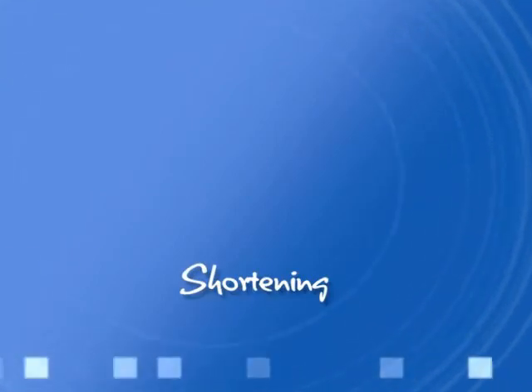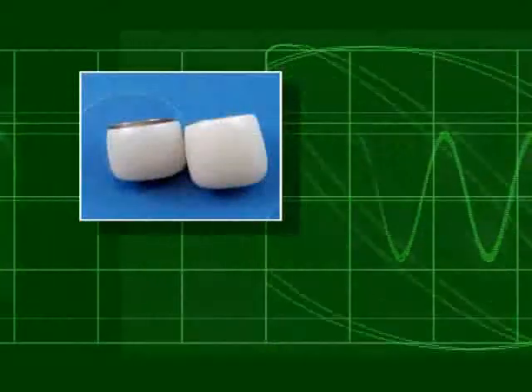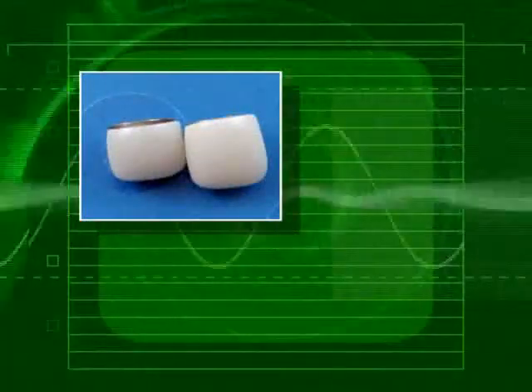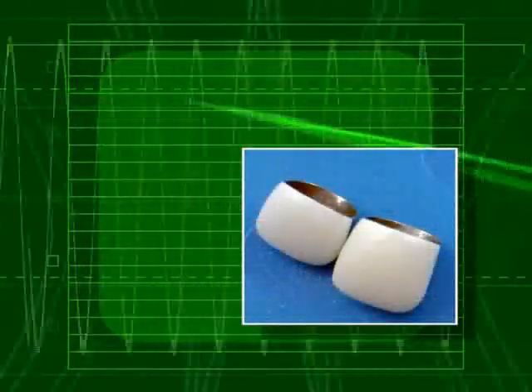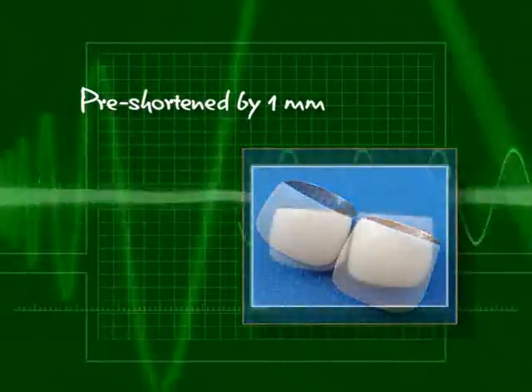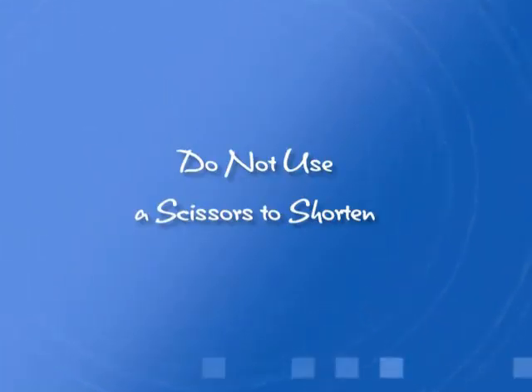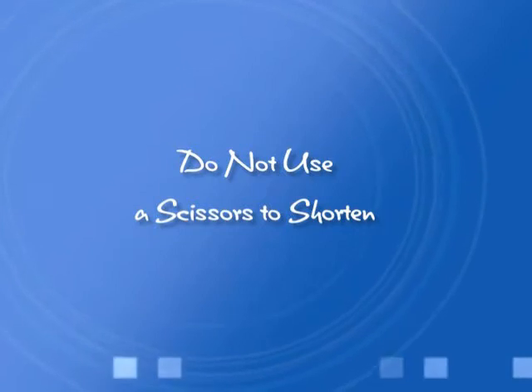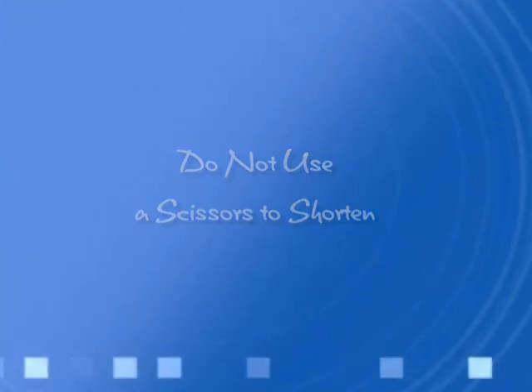Shortening. While fitting the crowns, you may find that you need to shorten them. This is not a problem. However, if you find that you have to shorten all your crowns, we can save you a lot of time and headaches. We offer our crowns pre-shortened by 1 millimeter. This will also save wear and tear on the composite interface. Do not use a scissors to shorten these crowns. If you need to shorten a crown, you may use one of the following techniques.